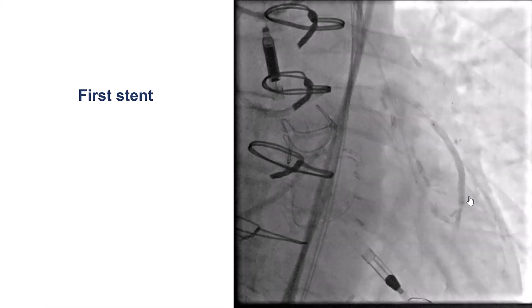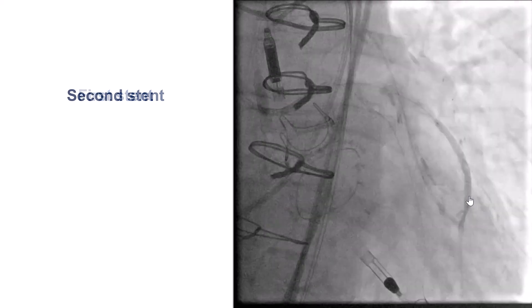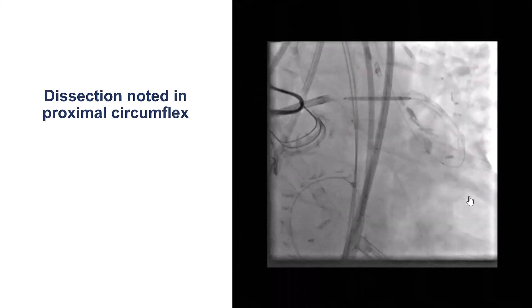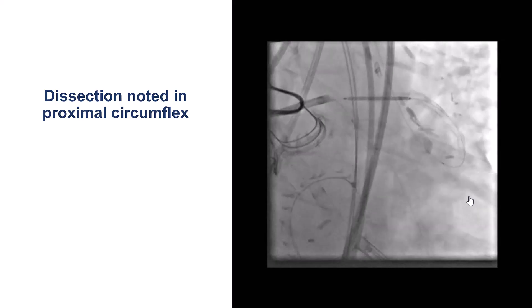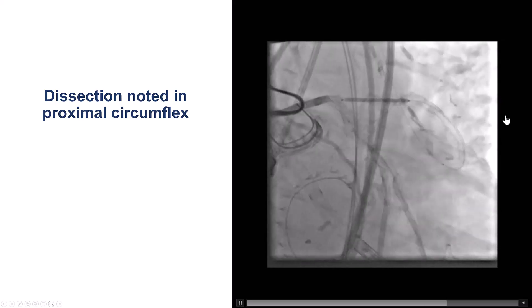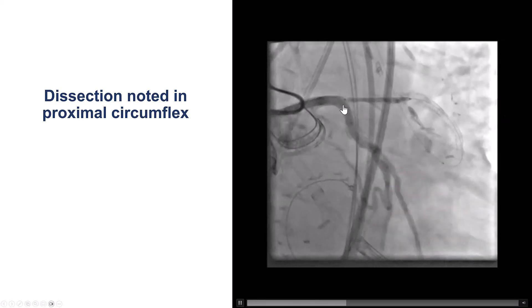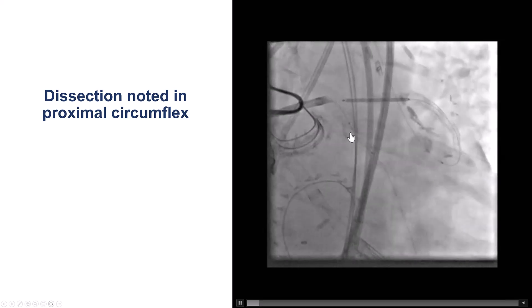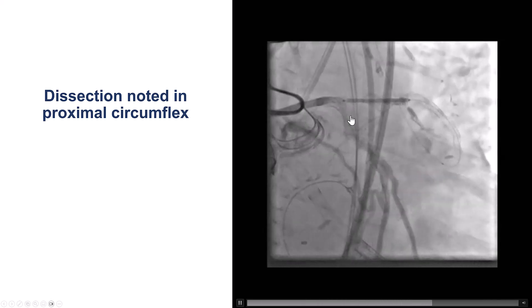We then started stenting from more distal to more proximal, placed the first and second stents. Then a third stent was placed going all the way from the LAD to the left main. But at this point, there was some haziness and some dissection into the proximal circumflex.